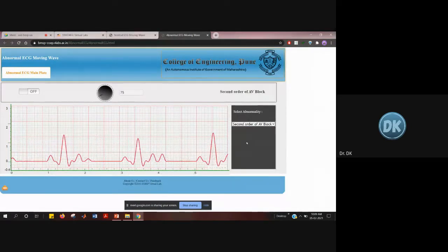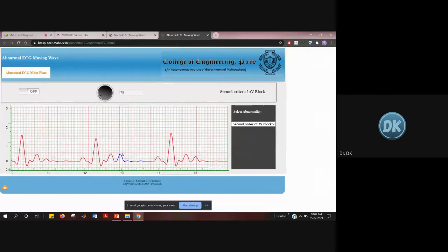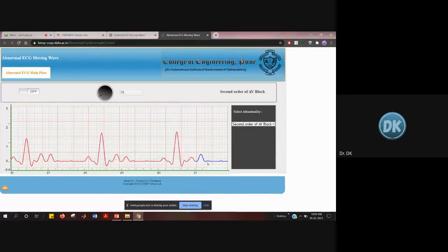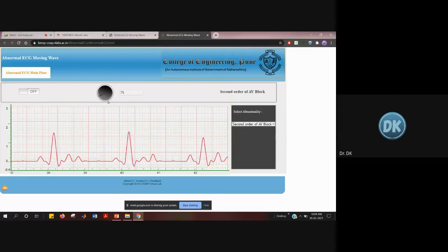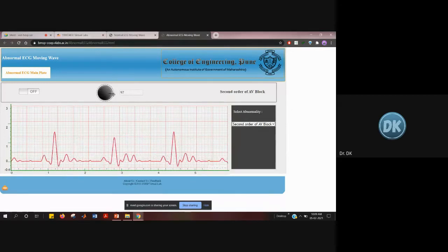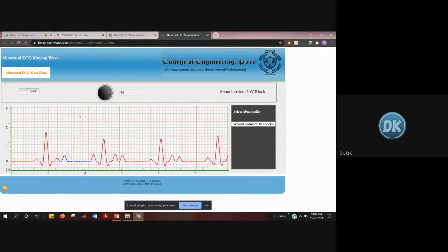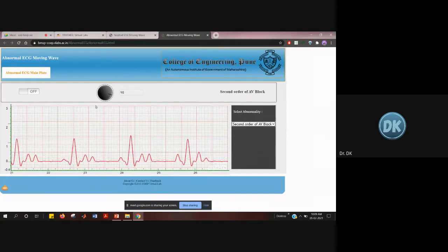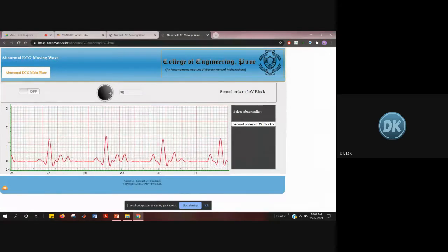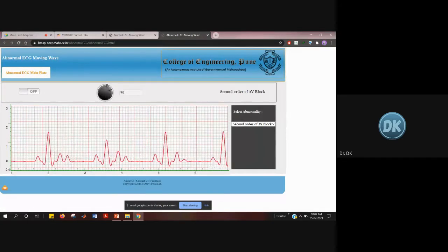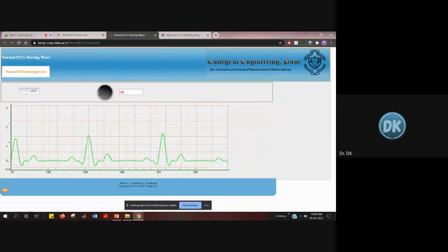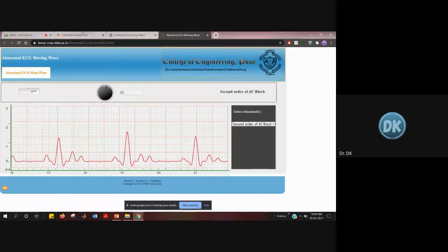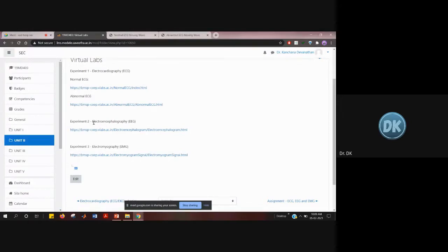There is also a second-degree AV block — you can see a change in the amplitude and frequency of the waveforms. You can also change the number of waveforms by rotating the control. So this covers normal and abnormal ECG conditions. The second experiment is electroencephalography.